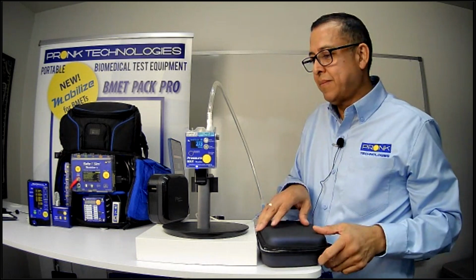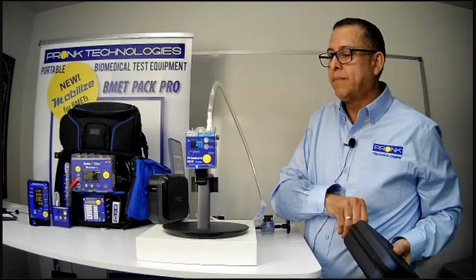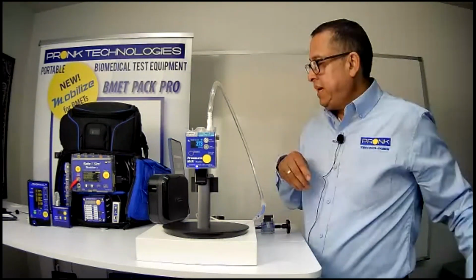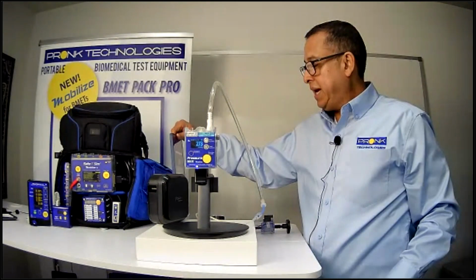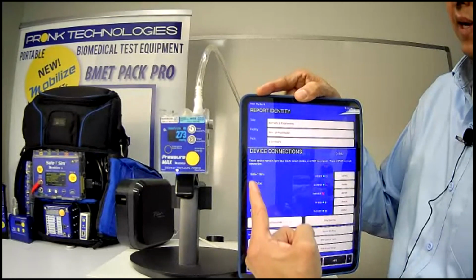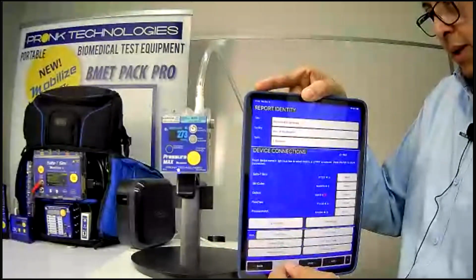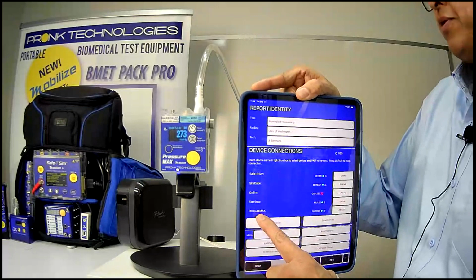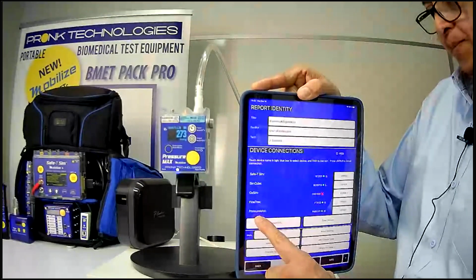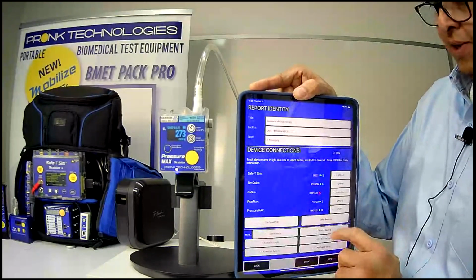All right. And then someone asked, how do you pair the pressure tester to an iPad or iPhone? Yeah, so on the next release of our Mobilize app, you'll see it and have it available to do that by going into the setup menu. You'll see a section here that's device connections. And on the next release that will be available coming early next year, you'll see another new device called Pressure Max there. And when Pressure Max appears, you'll be able to pair to it like you do our other devices.